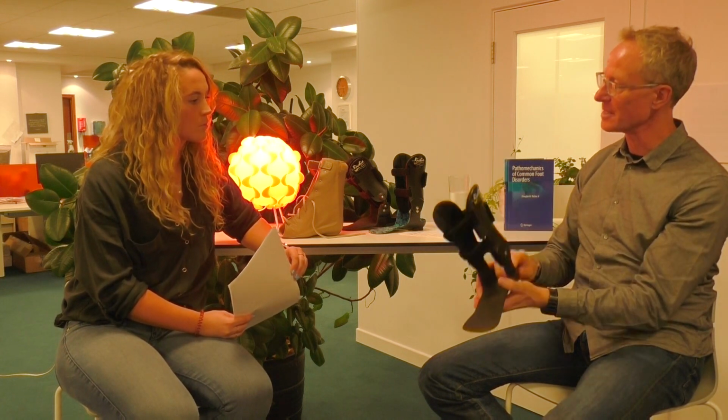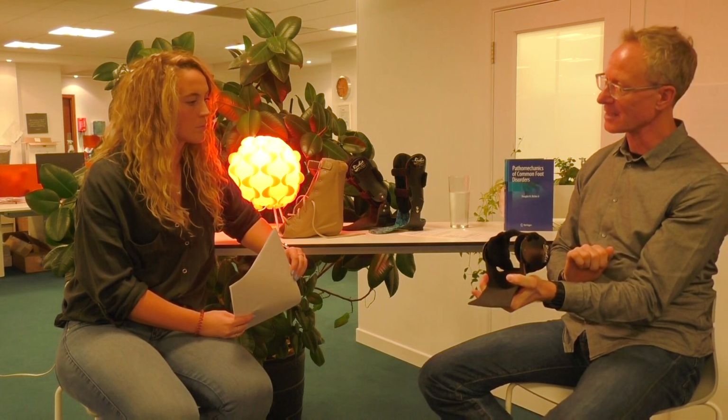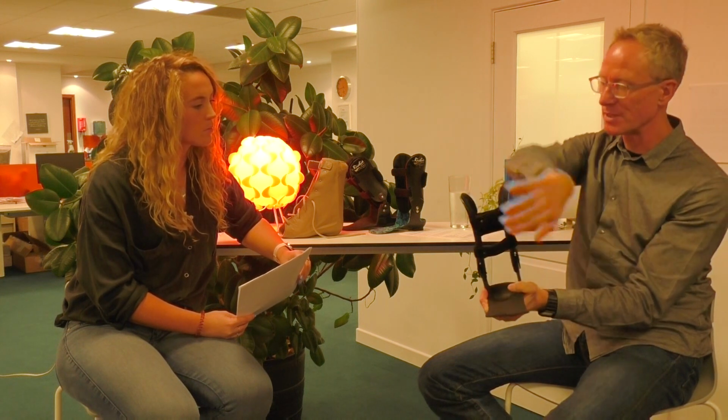You do have to be quite robust in getting it into the shoe. So you'd normally remove the insert and then slip this in. This would be sitting back like so. These ones would be open, and then the person puts their foot into the trainer, make sure the laces are opened nice and wide, and then you would pop this up and make sure it's nice and tight here.